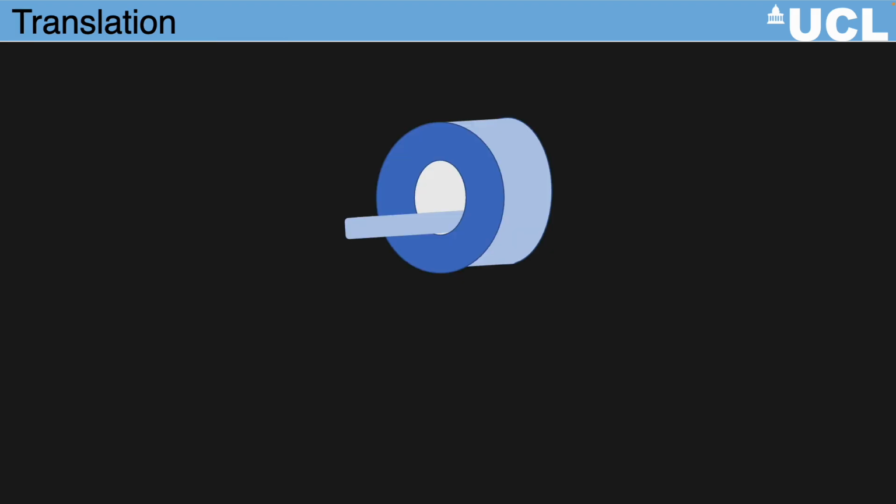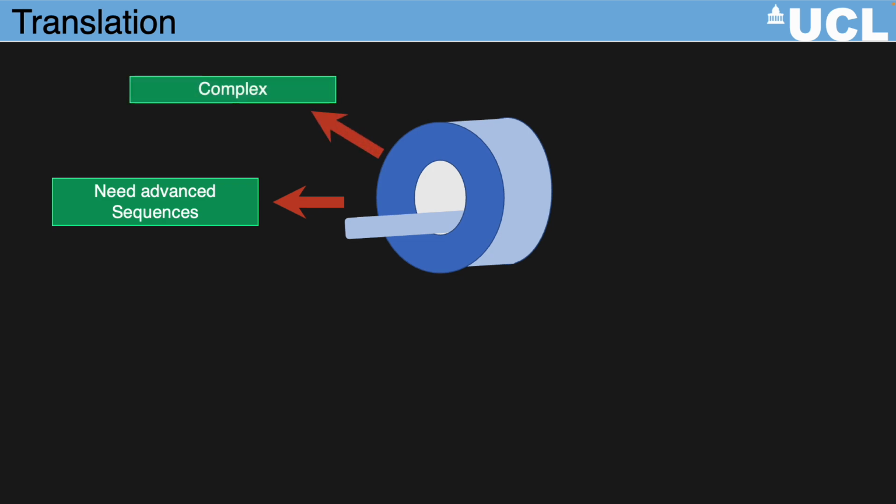But even if you are a maths wizard, how do we translate these complex methodologies into the clinical environment? As I've shown, these advanced imaging techniques often require the use of non-standard optimised sequences which are not available on all systems. The advanced reconstructions are mathematically complex, requiring gridding if they're non-Cartesian, and often have time-consuming iterative reconstructions.